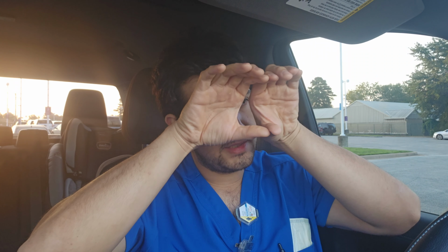Let's see what else we got. Sometimes the device that locks the tube in place, like when you swing out the tube and angle it, there's a knob that holds it in place, because for cross tables or different views, you have to angle the tube head in a certain way. Sometimes there's a little knob you hold. This is for the Fujis. Some of the GEs and Siemens don't have that. So there's that.